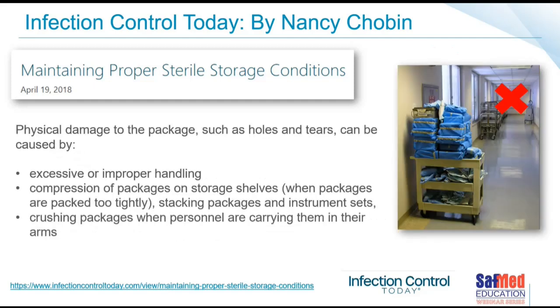So remember, that includes the operating room. Physical damage to the package, such as holes and tears, can be caused by excessive or improper handling, compression of packages on storage shelves, when everything is packed too tightly or squeezed into a small area, when we're stacking packages and instrument sets, and crushing packages when personnel are carrying them in their arms, which of course we should never do. Always carry a sterile set or a sterile pack, preferably on a trolley and not close to your body, if you really have to carry it by hand.